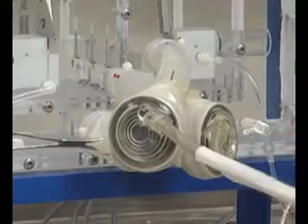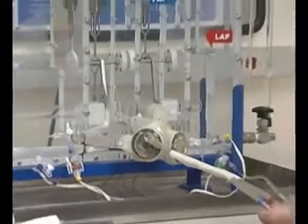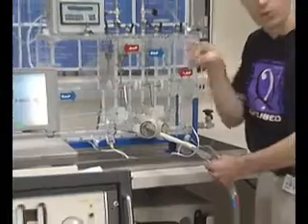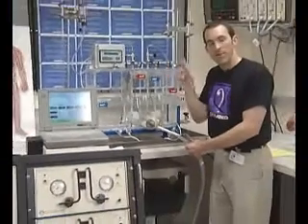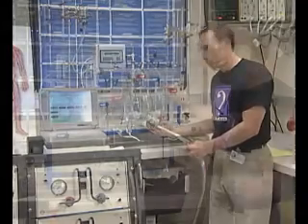So the sound that you're hearing now is the opening and closing of the metal valves. As we talked about when we looked at blood flow in series, of the ins and the outs, going into the valves and out of the valves, that's exactly what you're hearing here.